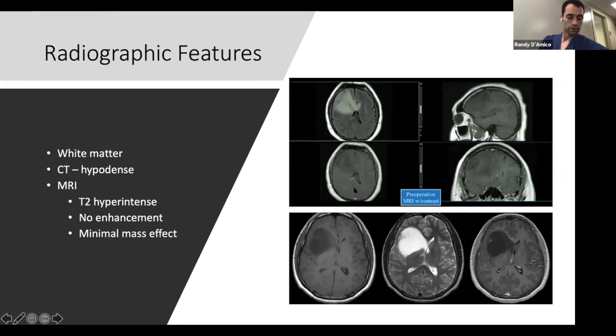All right, so that's basically the radiograph. That's the majority of what we look at for radiographic images. Sometimes we can do something called spectroscopy, which is an MRI technique that looks at basically the metabolism of the lesion you're looking at. In tumors, you'll see increased metabolism, increased cell turnover, things that suggest a tumor versus an infection, which is going to look different, all right?